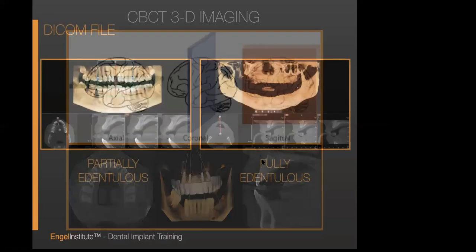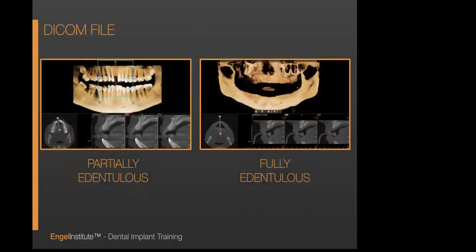Okay? All right. So now, as we gather the CBCT, by the way, guys, a little off the record, if you have CBCT machines, I want to give you a little pearl here. My recommendation to you is charge as minimal as you can for your CBCT scan. The idea is not to make a living off CBCT scans. The idea is to get them in the machine so you could have something to discuss with them that's very independent and pertinent for their own need.